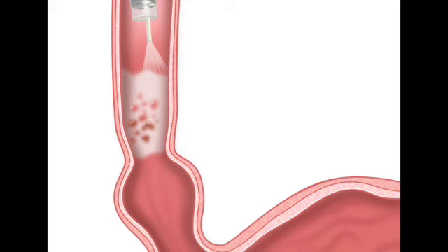We saw how this simple mist guides doctors to hidden dangers in the esophagus, outlines completely camouflaged flat polyps in the colon, and acts as a real-time chemical blacklight to guarantee every last trace of precancerous tissue is scrubbed from a surgical scar. And all of it achieved with virtually no serious side effects to the patient. It fundamentally changes the paradigm for gastroenterologists, upgrading them from relying on blind random biopsies to navigating with absolute visual certainty. It really is incredible.